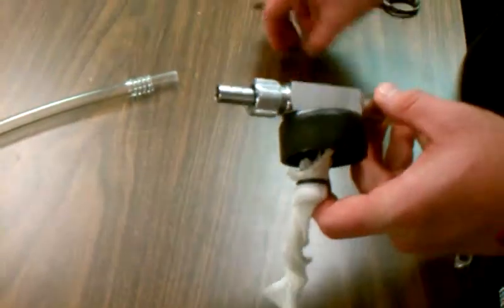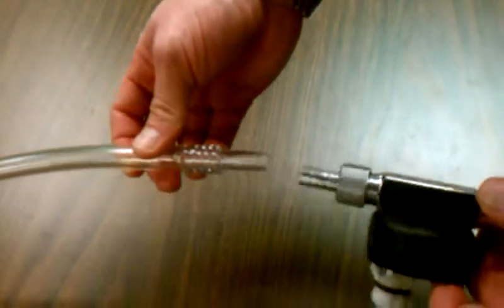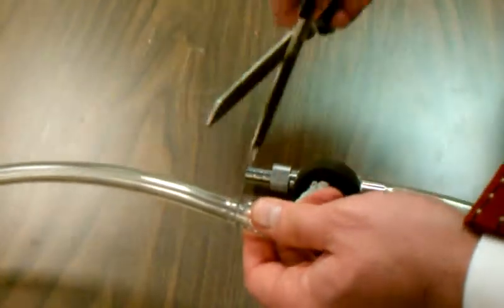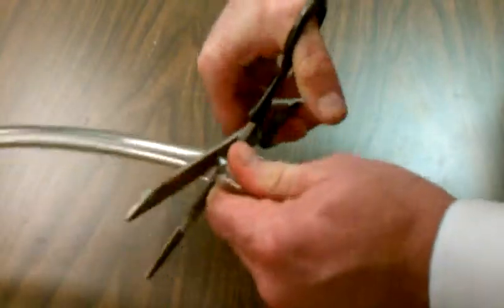However, the hoses that come from other suppliers have a hard plastic section to them. What you're going to need to do is cut that section off. So you simply take a pair of scissors and cut that section off like so.